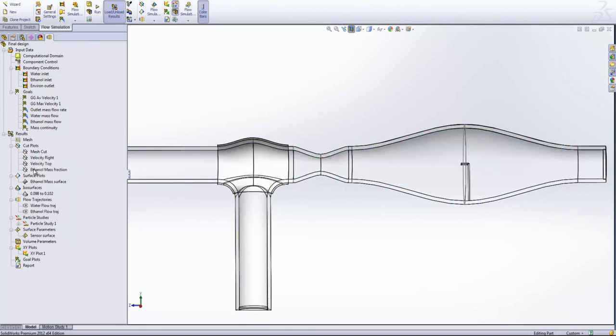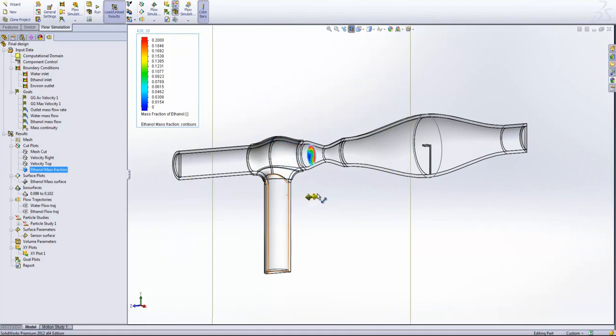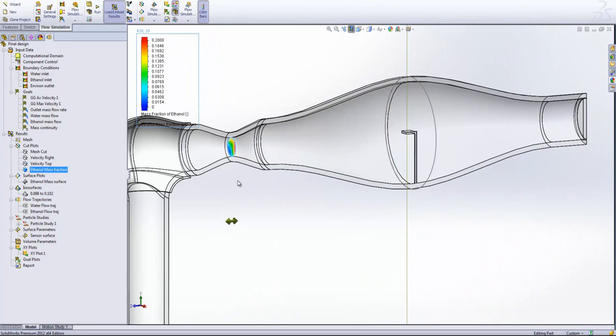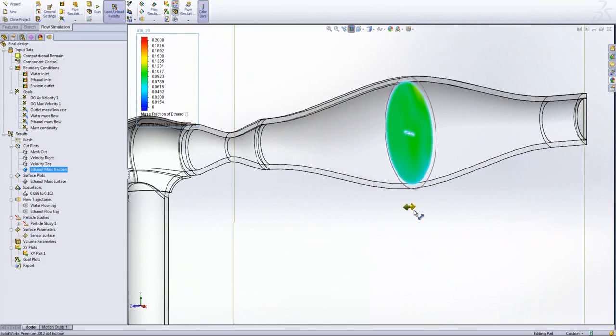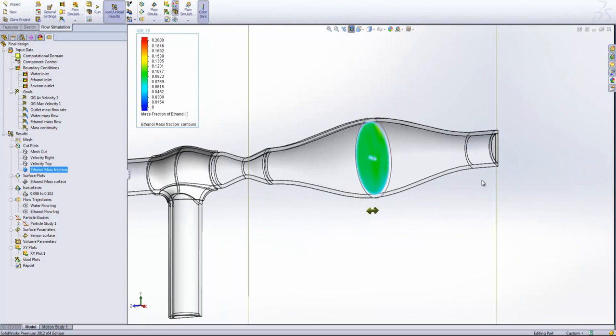More importantly, let's have a look at our mass fraction. So we've got the same plot that we've been using so far with 0 and 0.2 at our legend values, and as I drag this plot through, we'll see that upstream, the flow does look very, very similar to what we've had before. As we reach the nozzle, the two fluids do still look fairly separated, but because it's been accelerated and now it's being rapidly decelerated, we're getting a significant mixing action, and by the time we reach that sensor, you'll see that that sensor is slap bang in the middle of a nice big green region, which is absolutely ideal.